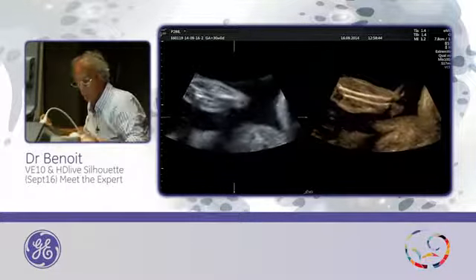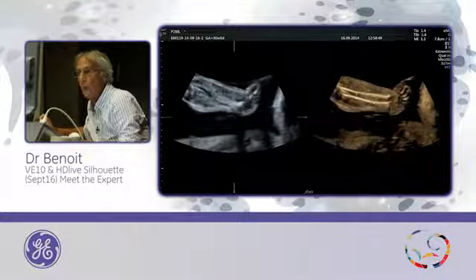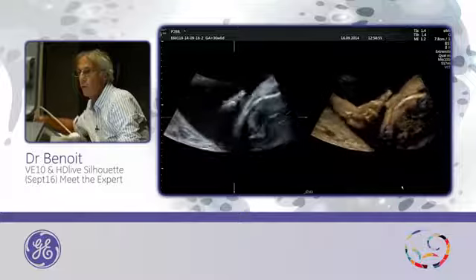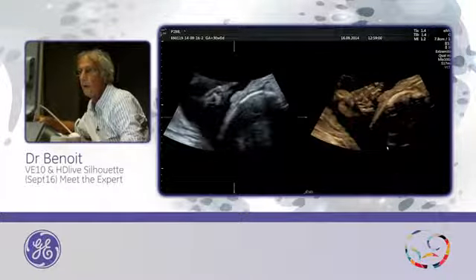You can see here when you play with the thickness, you can see the forearm with the two bones, hands with fingers, and especially late in the pregnancy, it's quite difficult to obtain.